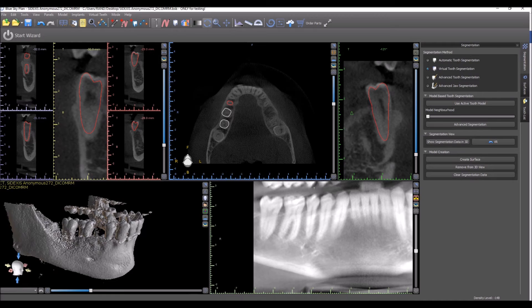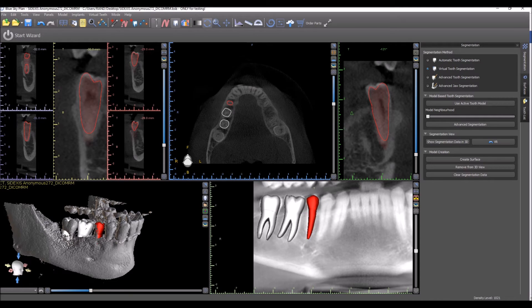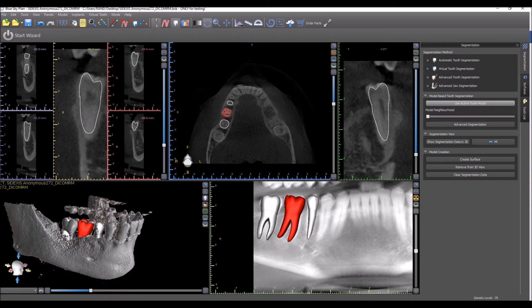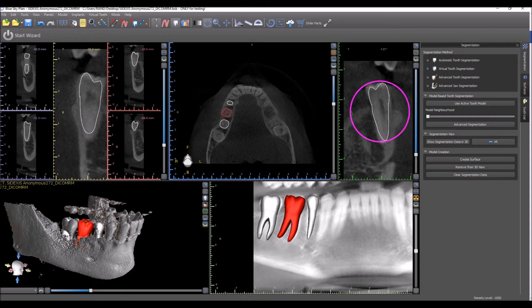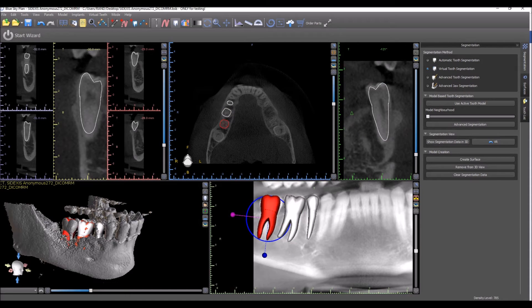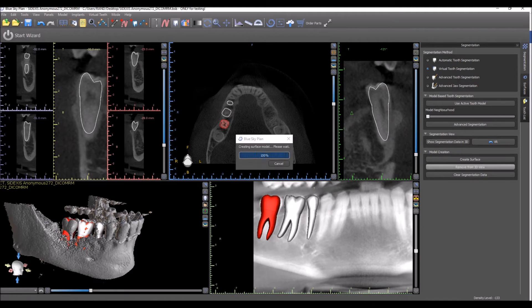Now we could go back to segmentation and repeat the process for our other virtual teeth. We can click on the next virtual tooth, choose 'Use Active Tooth Model,' preview it if we want, then create surface and remove from 3D. We're going to do it one more time: use active tooth model, create surface, and remove from 3D view.